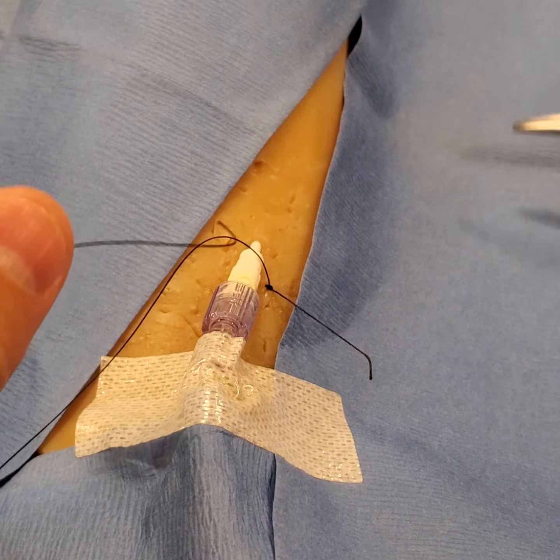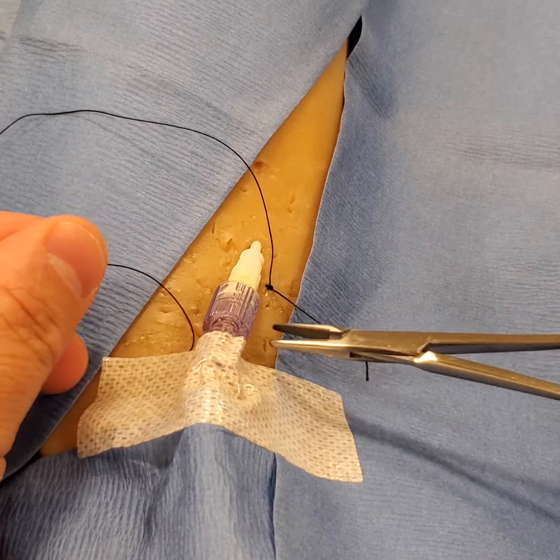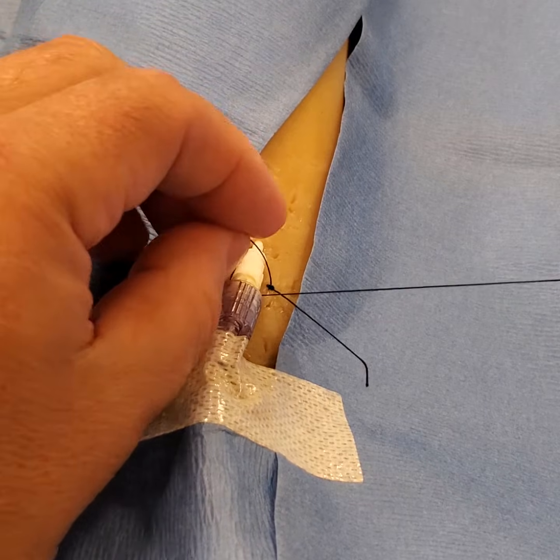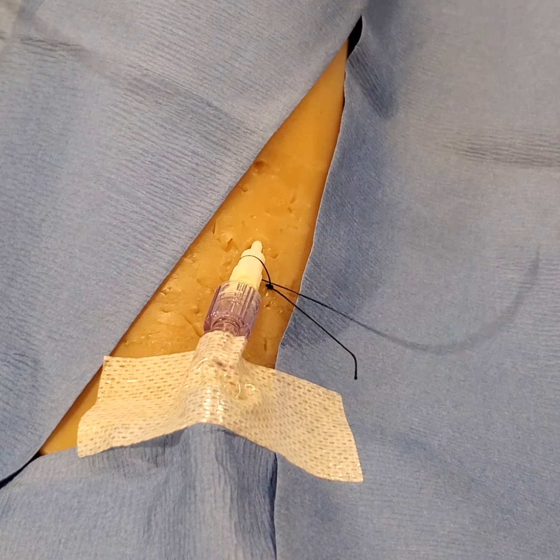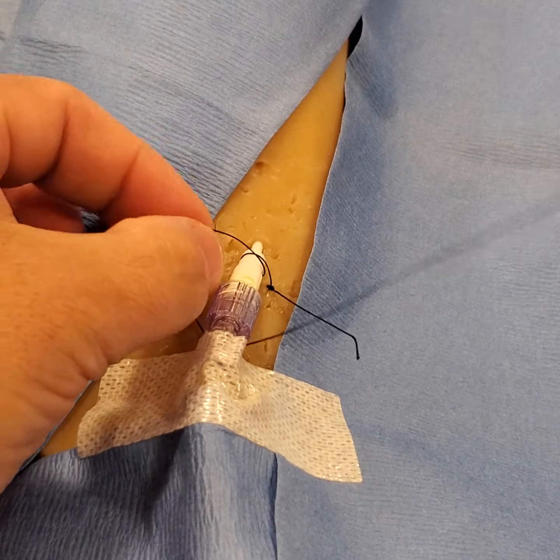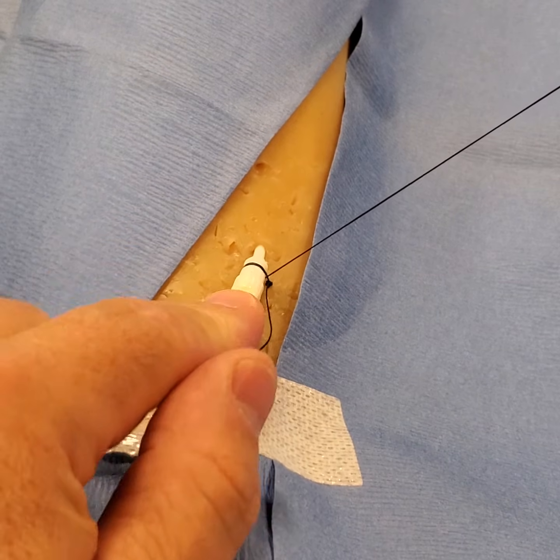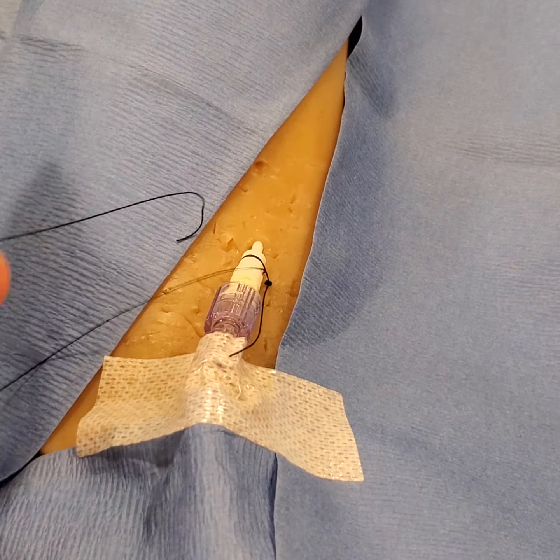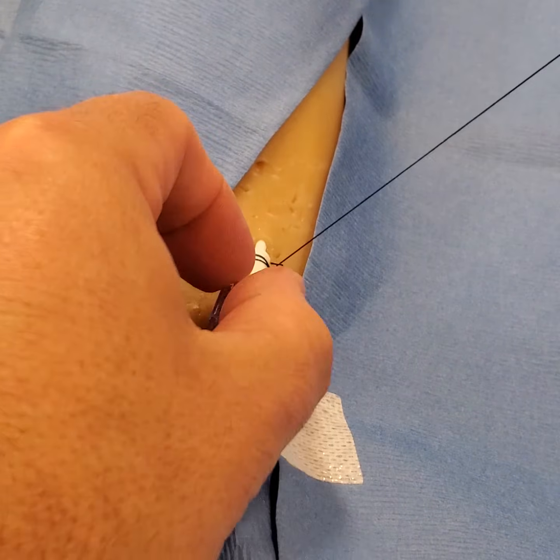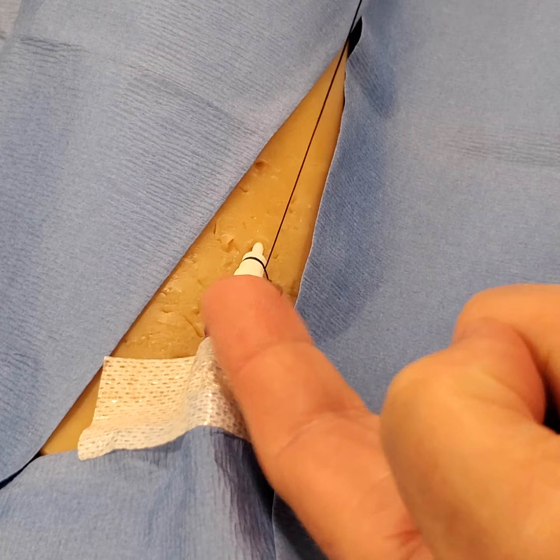Now you can follow through — go around the catheter twice, and fish it under using your needle driver to pull it through. You can see there's a natural groove in the catheter itself, so go around a third time for good measure.